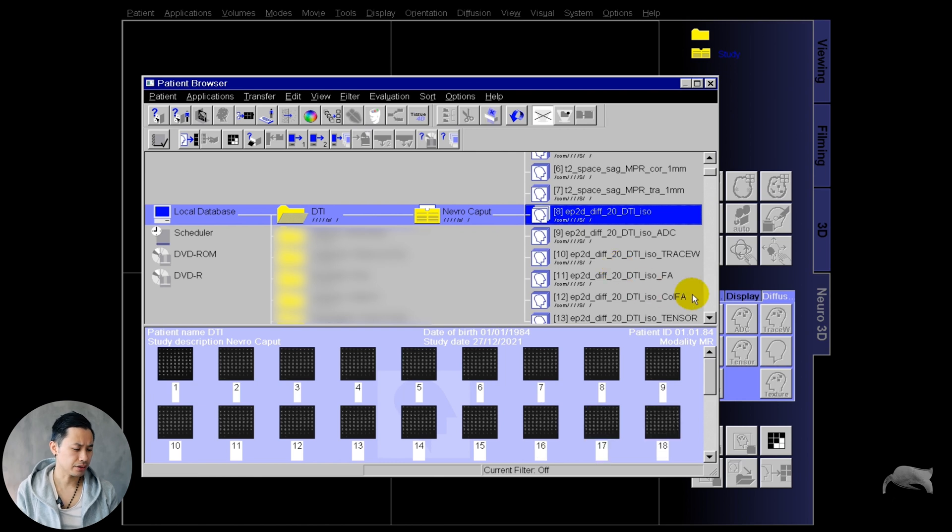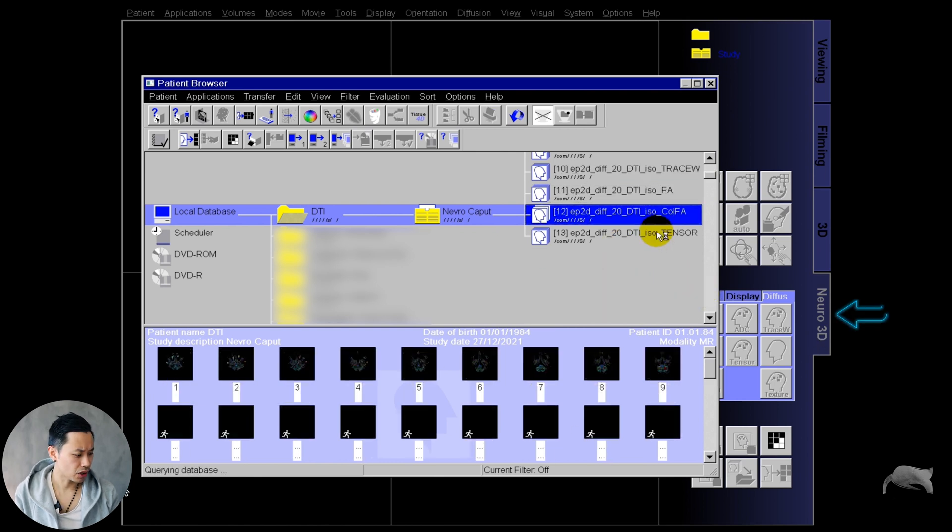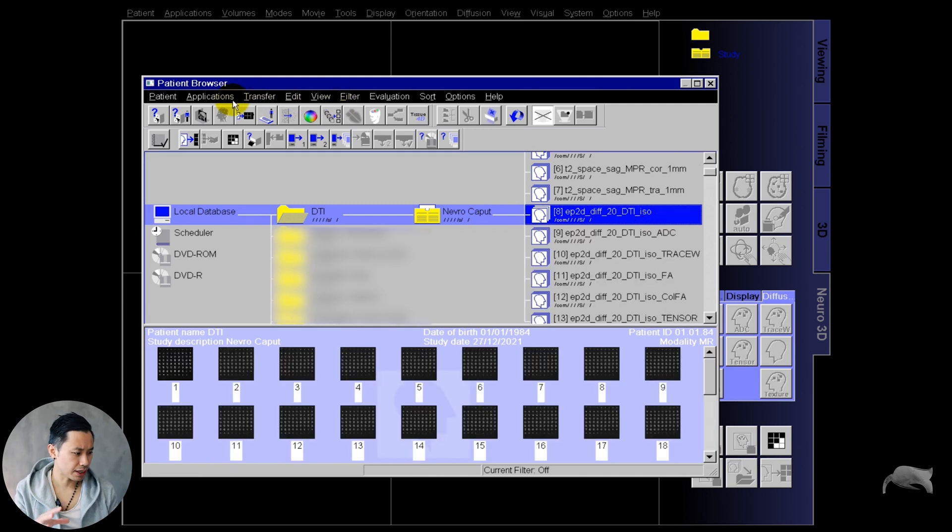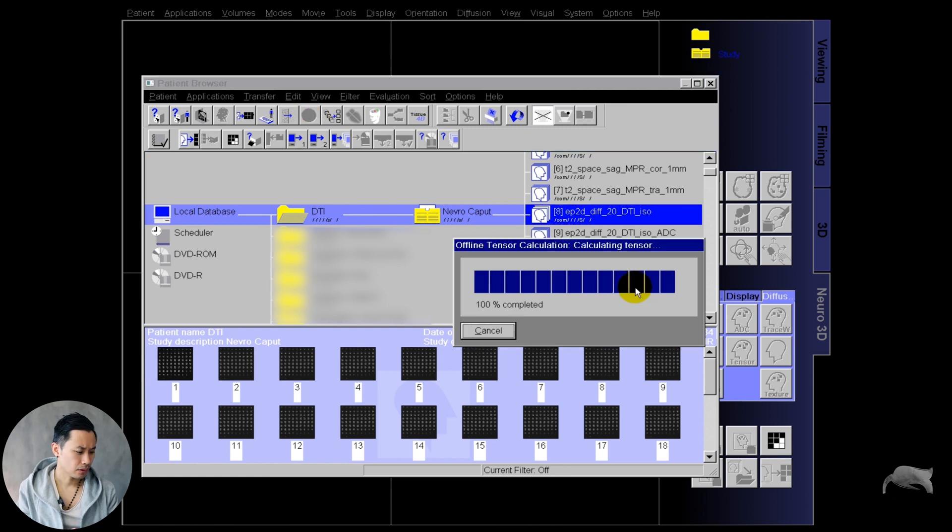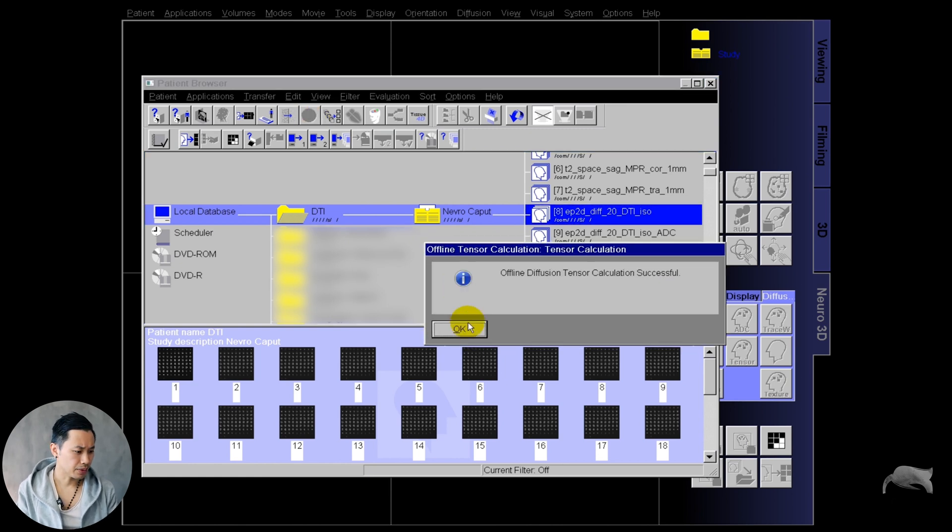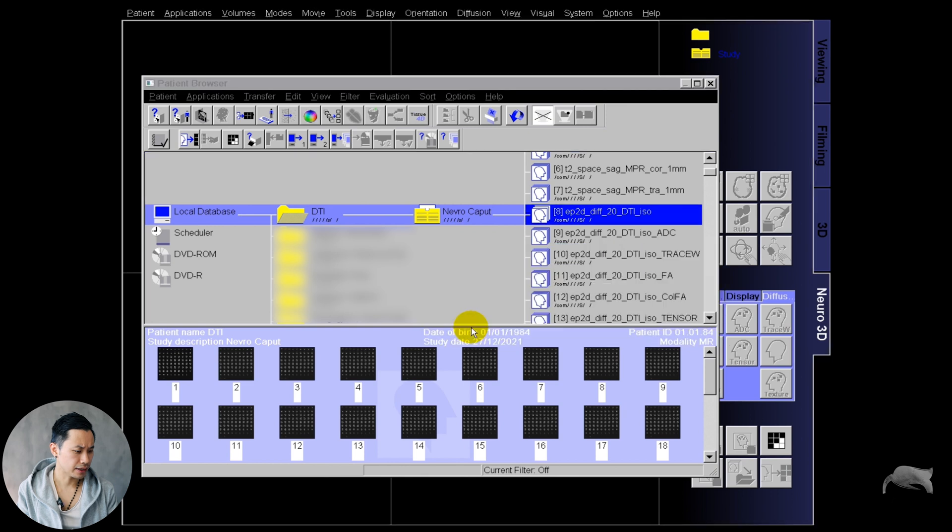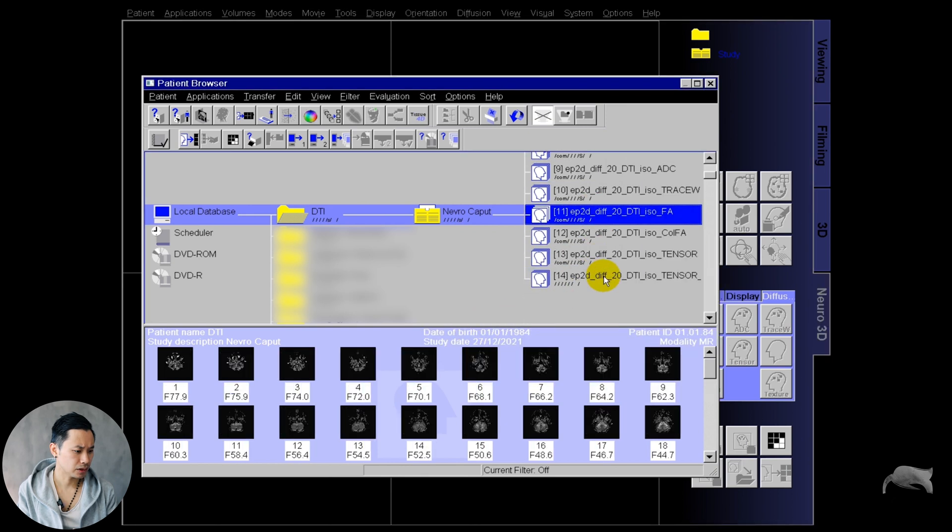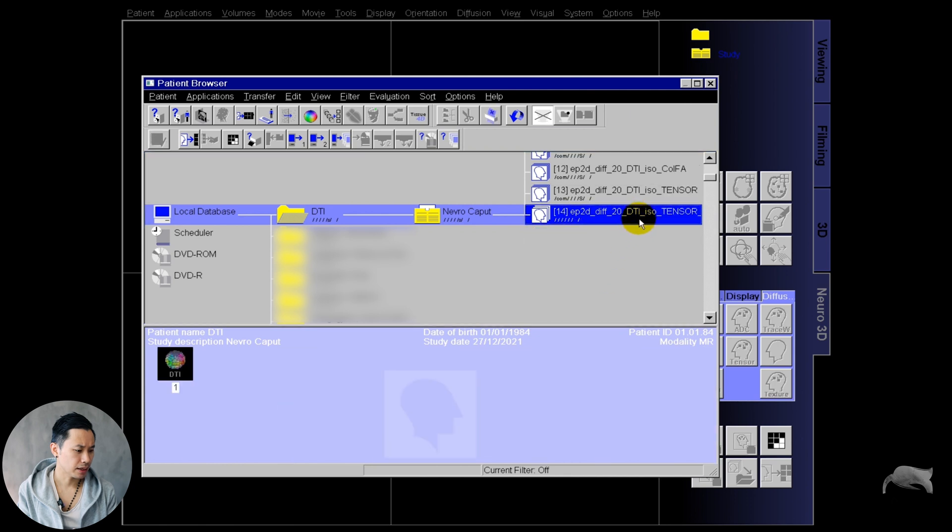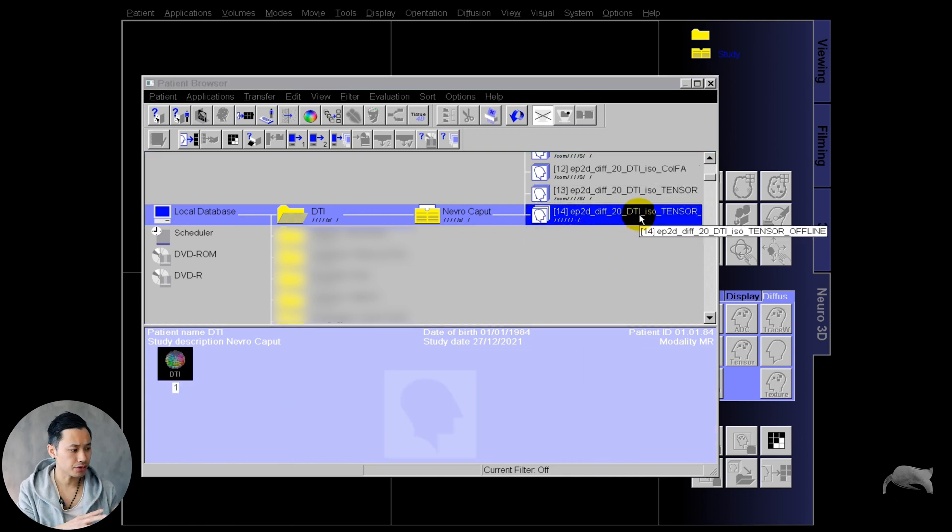Let's go into the browser. You see the DTI comes along with the ADC, the trace, the FA, the color FA, the tensor. We're going to use Neuro 3D for post-processing. Some people are using Syngo.via and others are using NeuroLab. There are so many third-party software. First we have to go for the offline tensor calculation, at the bottom you will find the offline tensor calculation. Now you can use the Neuro 3D.